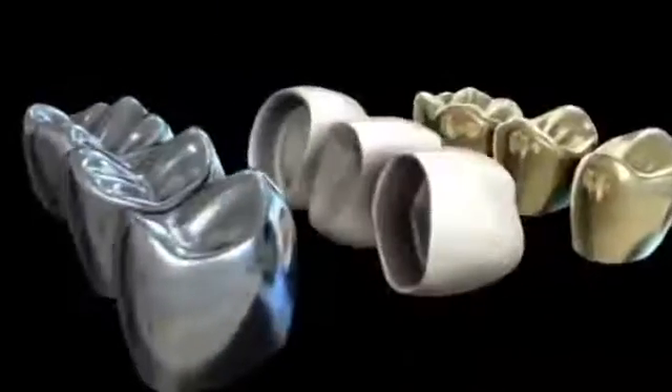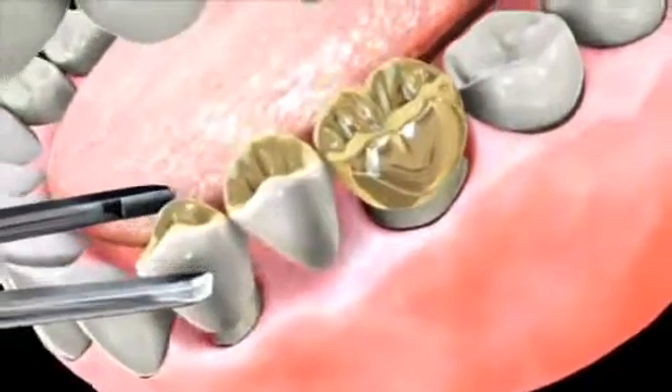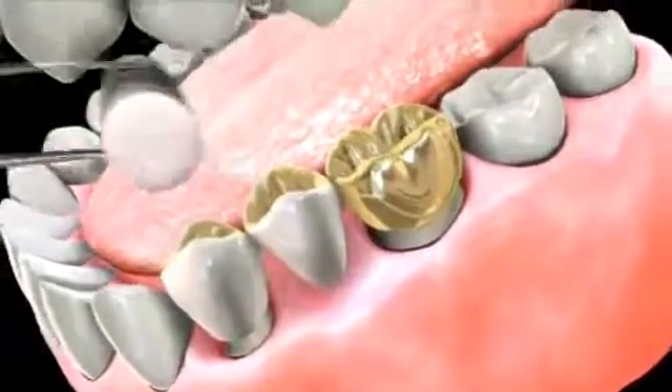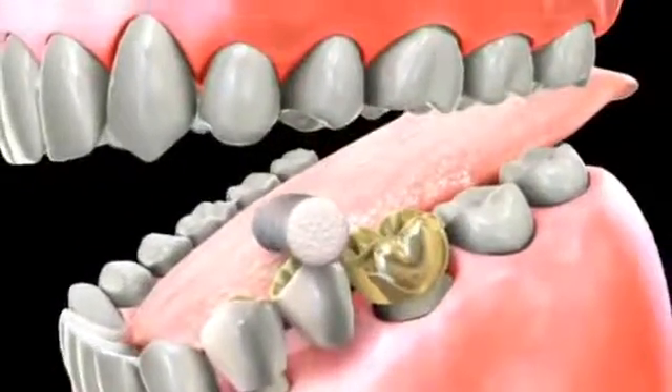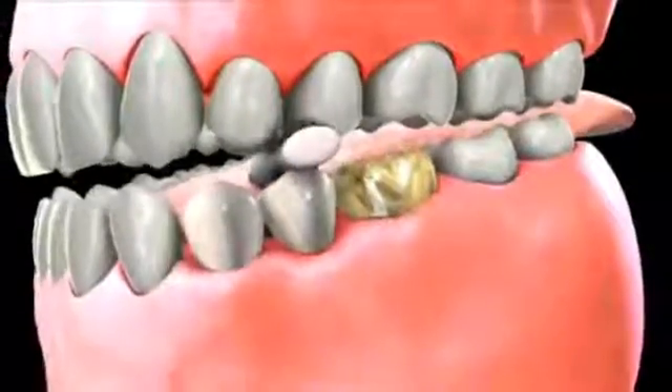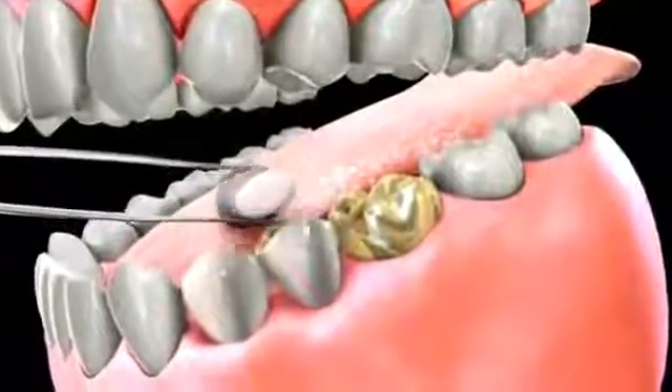Even though rare, a full metal bridge is more suitable for replacing a missing tooth in the back of your mouth. Metal bridges are often the best option for people who have worn their teeth excessively. Note, there are different metals to choose from, but as a rule, the more precious metal or gold content in the metal, the better the fit of the bridge, and the better the health of the gums around it.